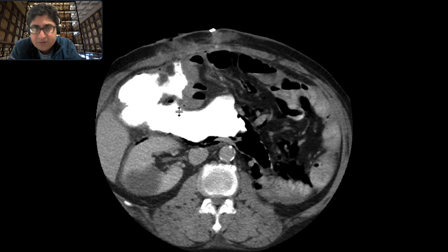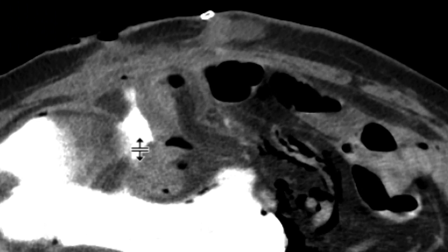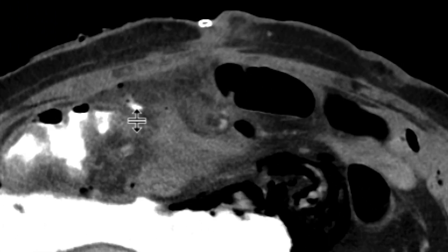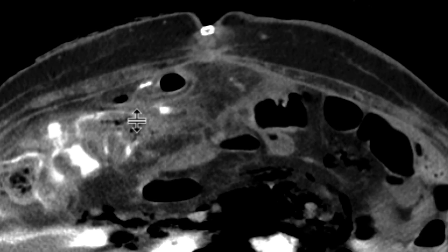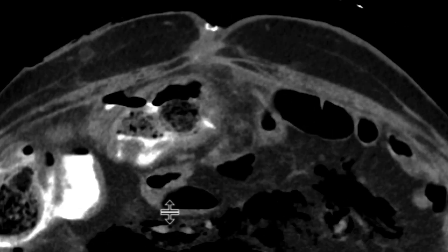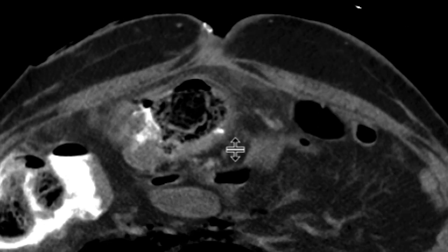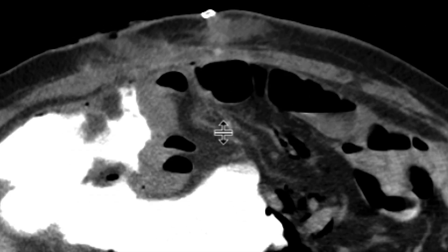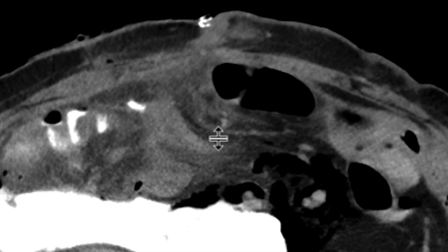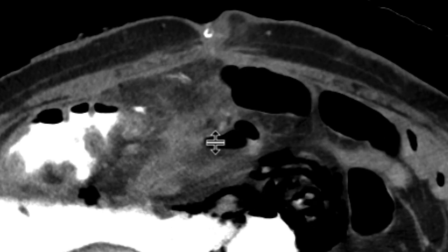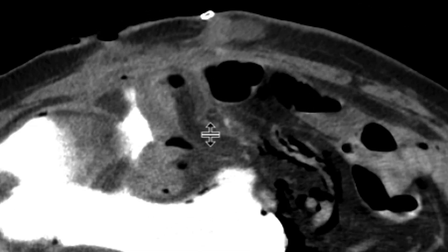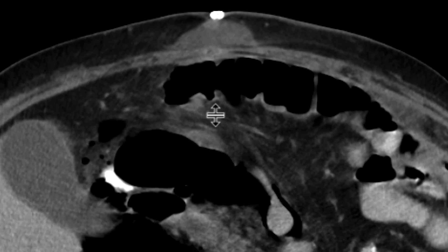As we scroll through it, we can see very carefully, going back over here, that there's a little track arising from this region, which is the region of the bowel anastomosis. You can see the bowel anastomosis here. From that region of the anastomotic suture that has broken down — there's a dehiscence — all this oral contrast is pouring into the abdominal cavity.